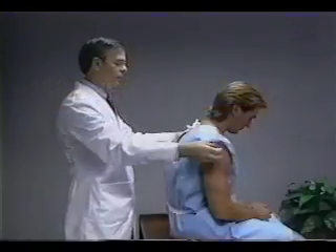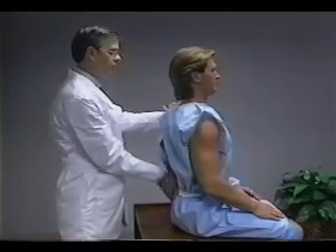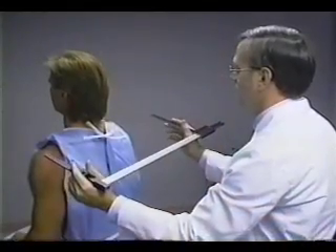For the biacromial breadth measurement, the subject sits upright with a noticeable curvature in the lower back. The shoulders are relaxed, with the hands resting on the lap. The technician stands behind the subject.